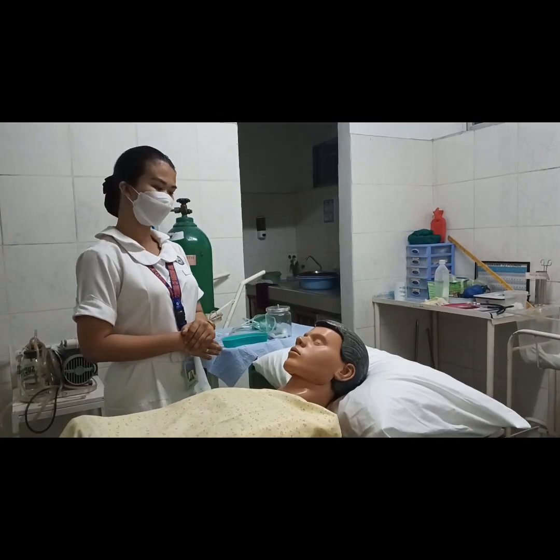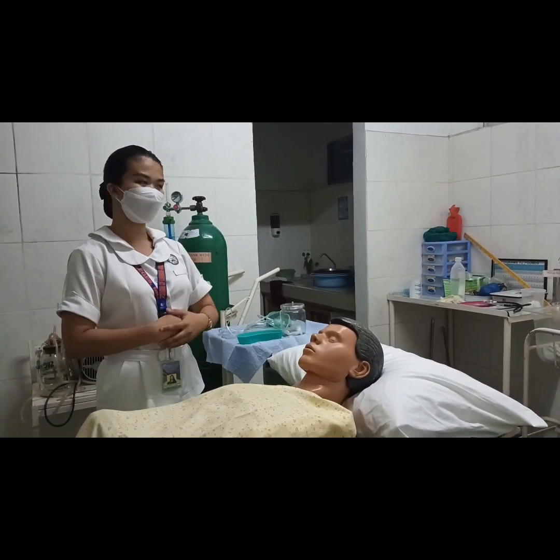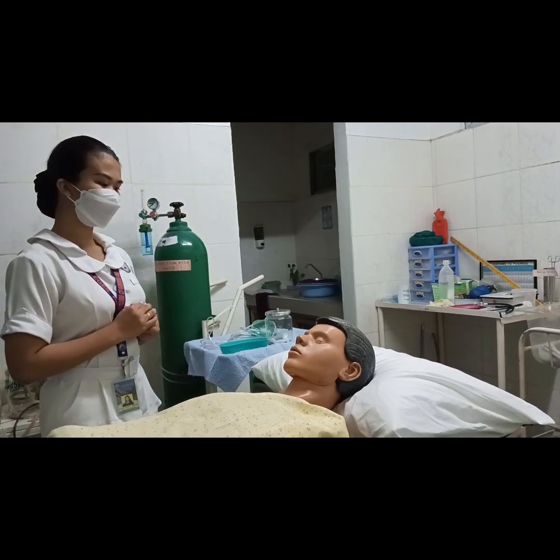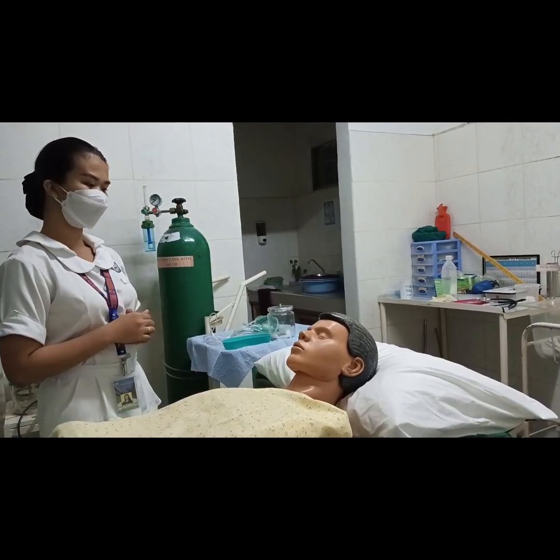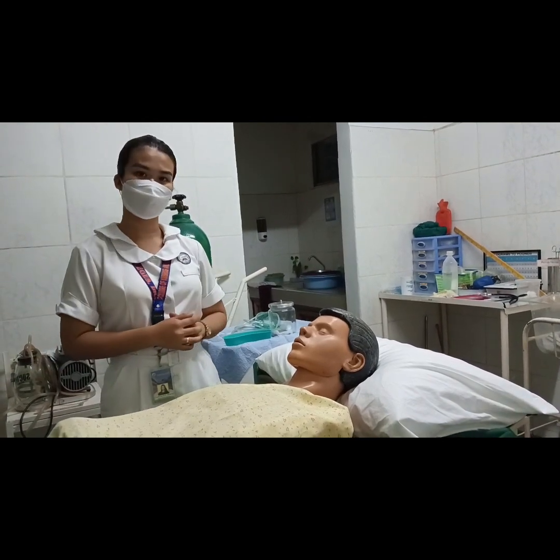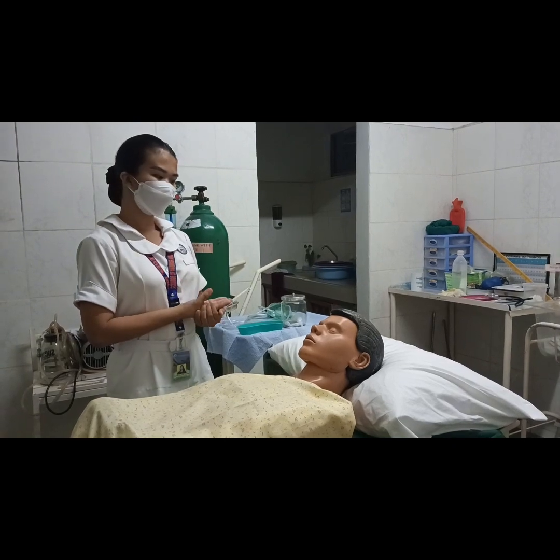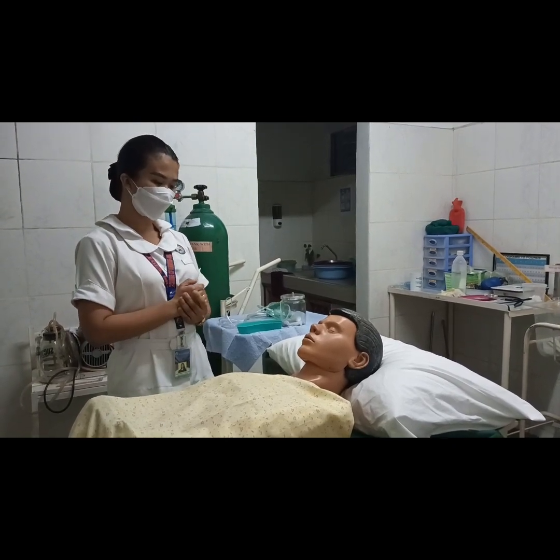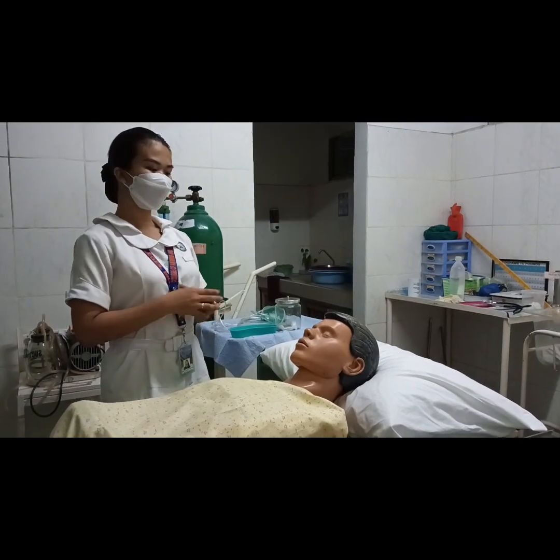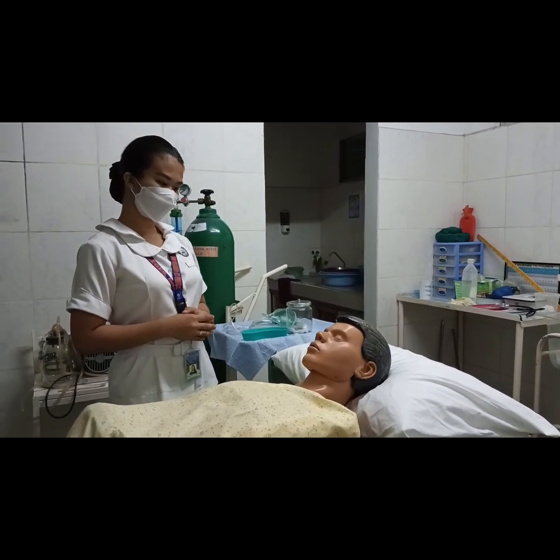Hello sir, I'm coming in. I am your student nurse for today from Mabini Colleges. May I know your name and your age? Assuming that the client answers — today I'm going to administer you an oxygen therapy to relieve your respiratory distress.